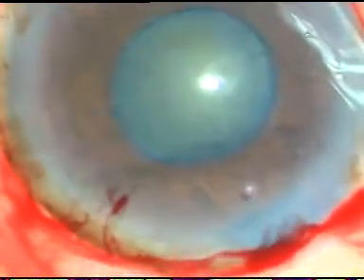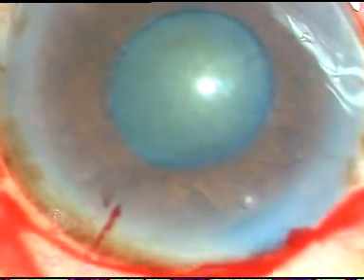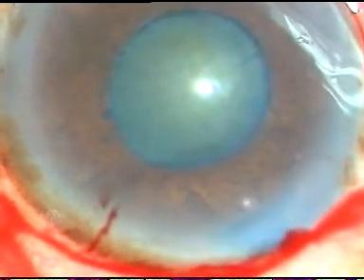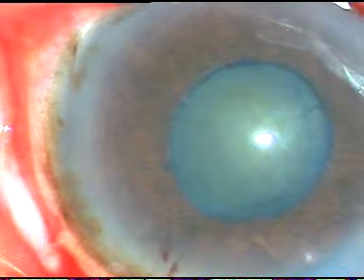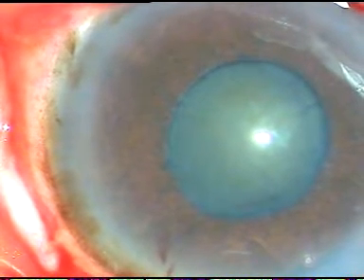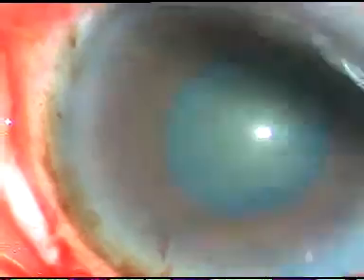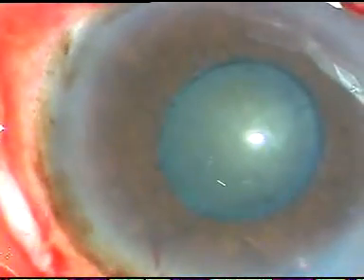Four stab incisions and I have planned to use 4 iris hooks in this case. This is a real time surgery. This surgery has not been edited at all and you can watch each and every step of the surgery. You just have to have patience for 16 minutes.